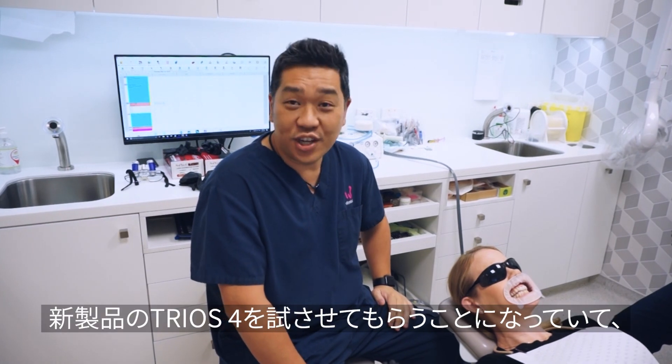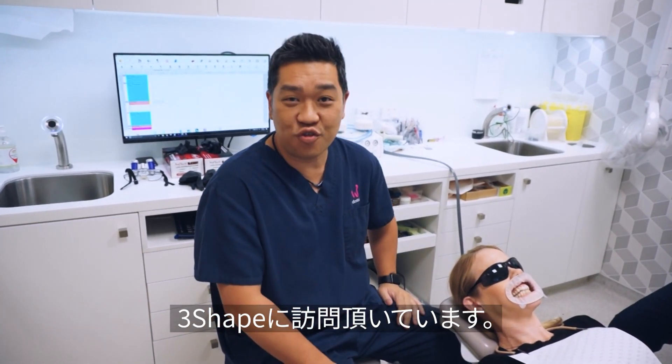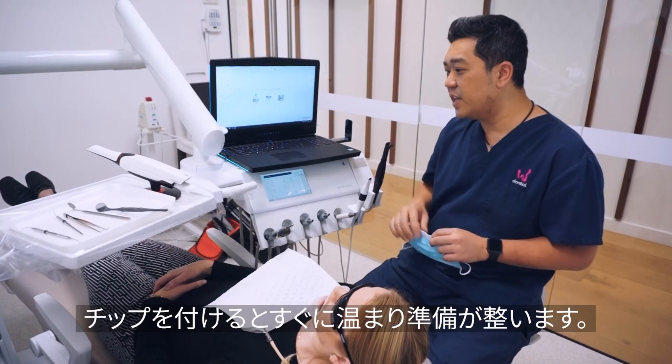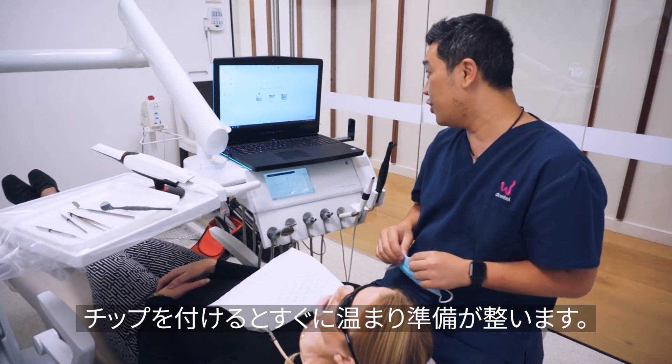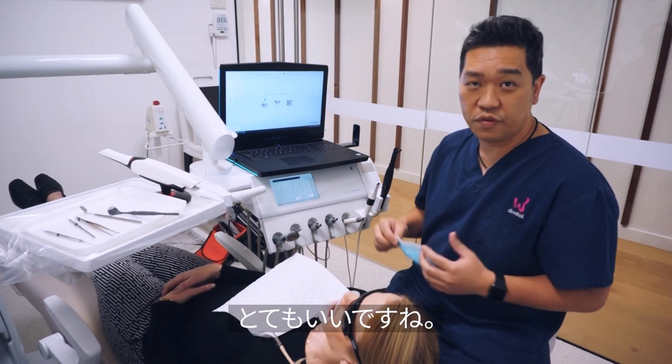We're here after work on a Wednesday — dentistry never stops. 3Shape decided to pop in and bring the new Trios 4 for me to try. One of the cool features of the new Trios 4 is the tip: as soon as you put the tip in, it's really warm and ready to go. I haven't even put my gloves on and it's already ready for me to scan.